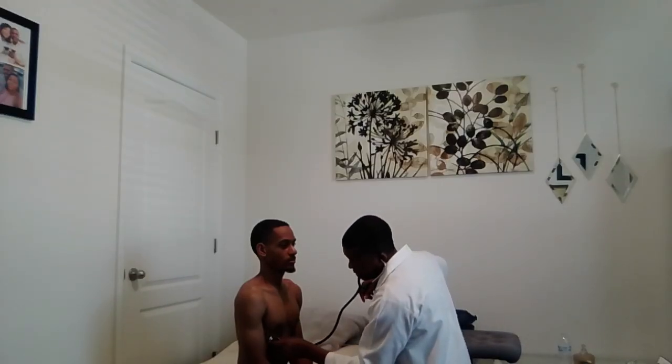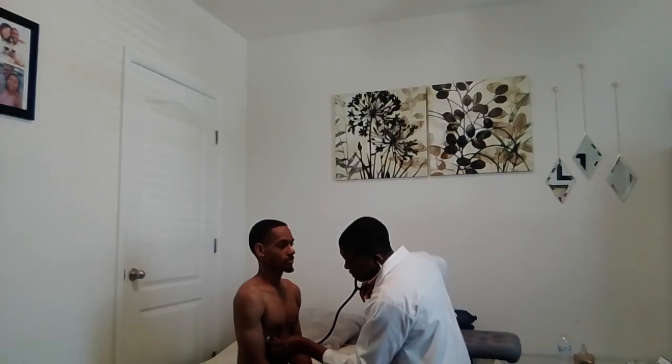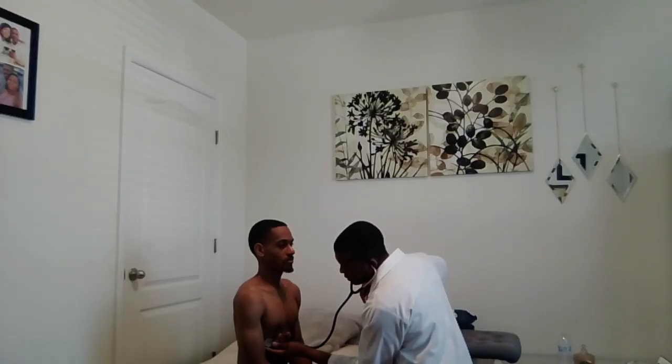And the PMI, mid-clavicular. I'm going to palpate first with the tip of my finger, my bell. Excellent. All right, Frank.